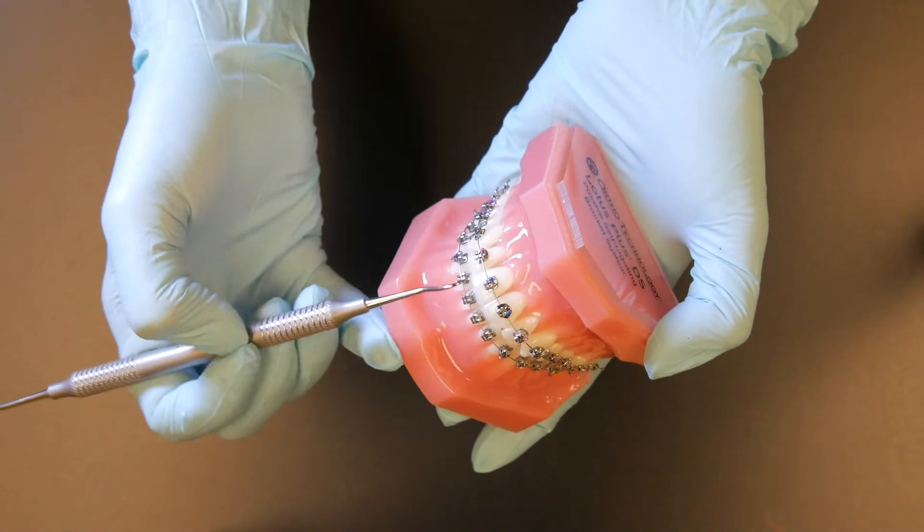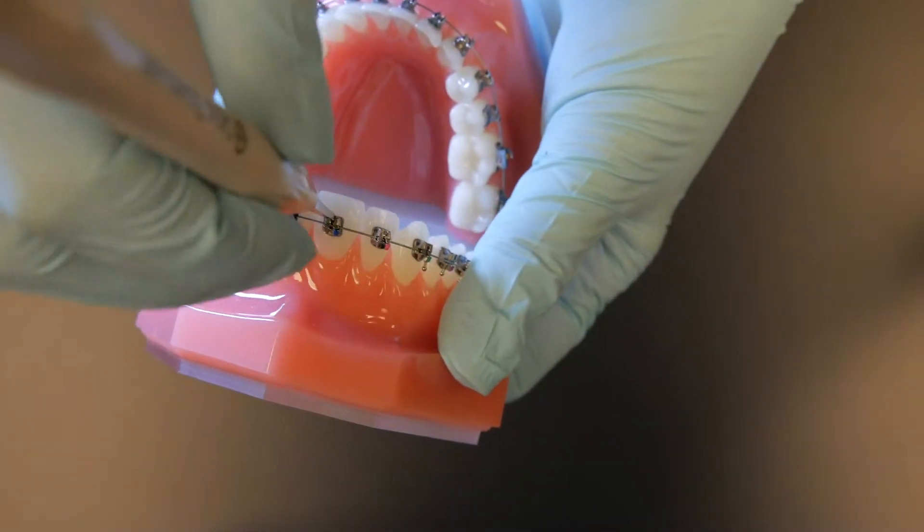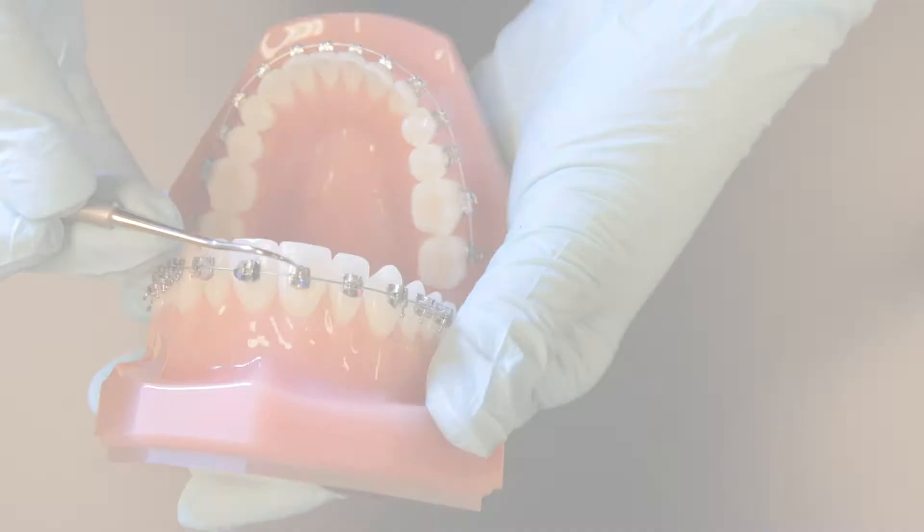What I also like about this bracket is you do not need a special instrument to open it. We do have one that makes it easier for you, but it opens easily with just the use of an explorer.